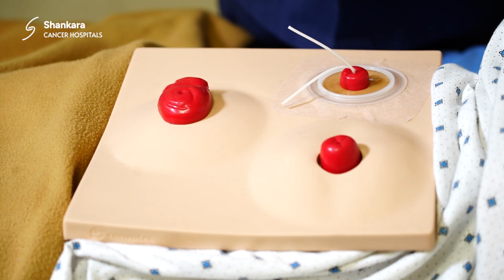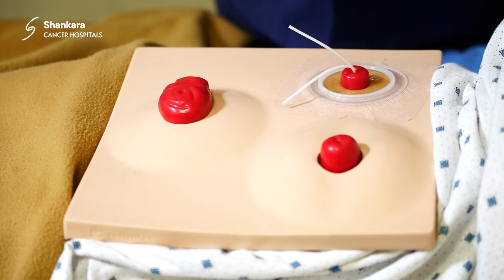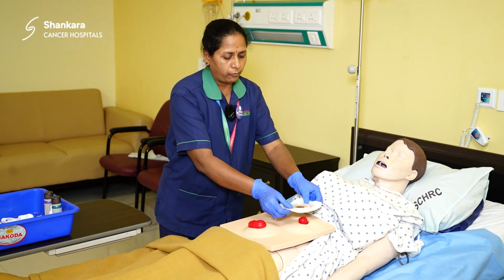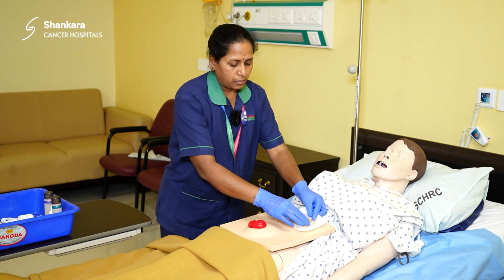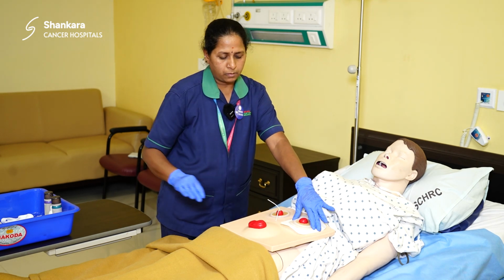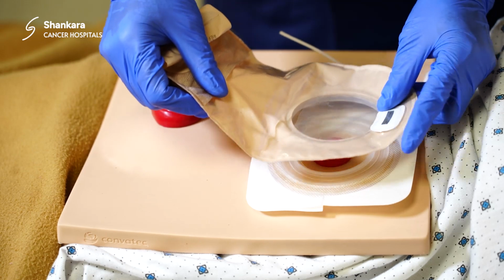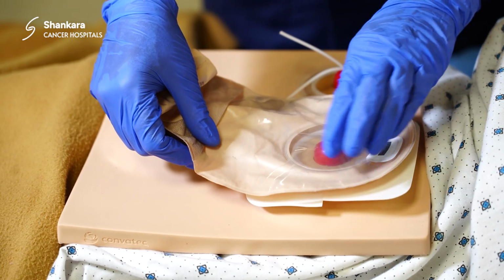Take a flange, check for the size. If it is the correct size, then apply the flange, secure it properly, then fix the bag as per their wish.